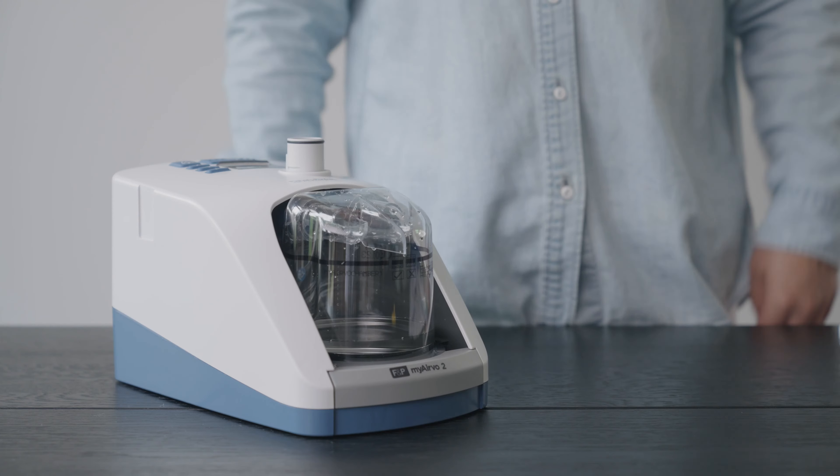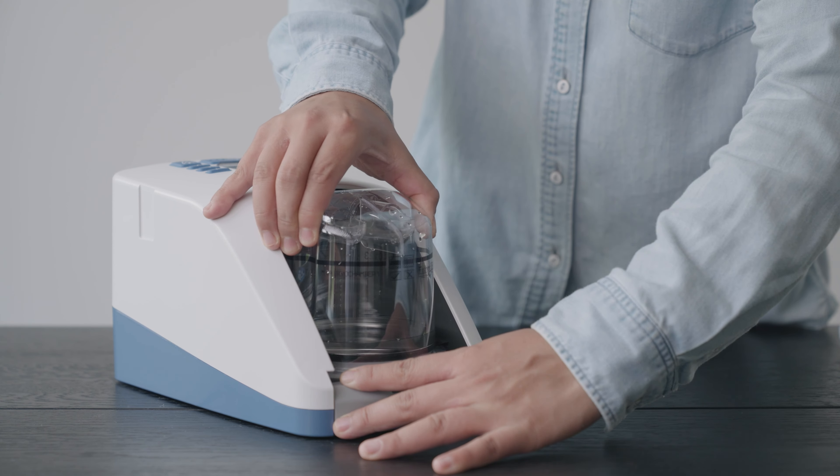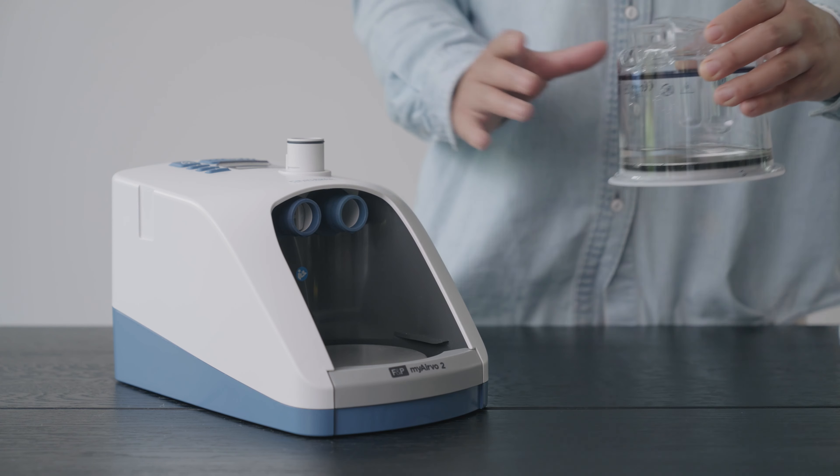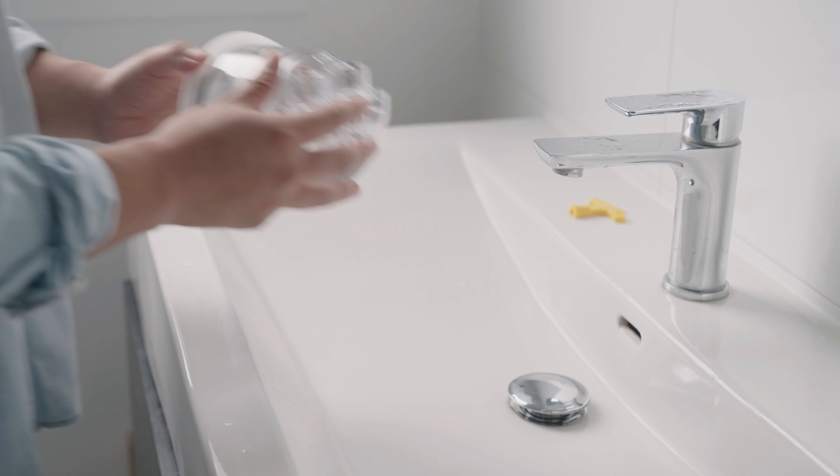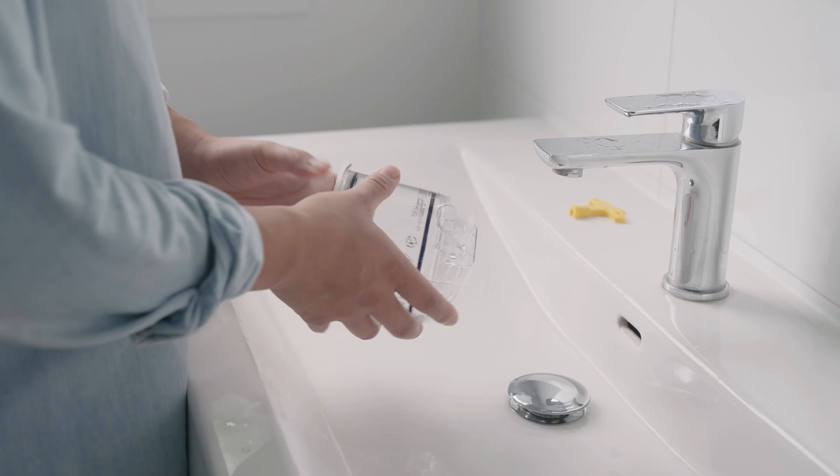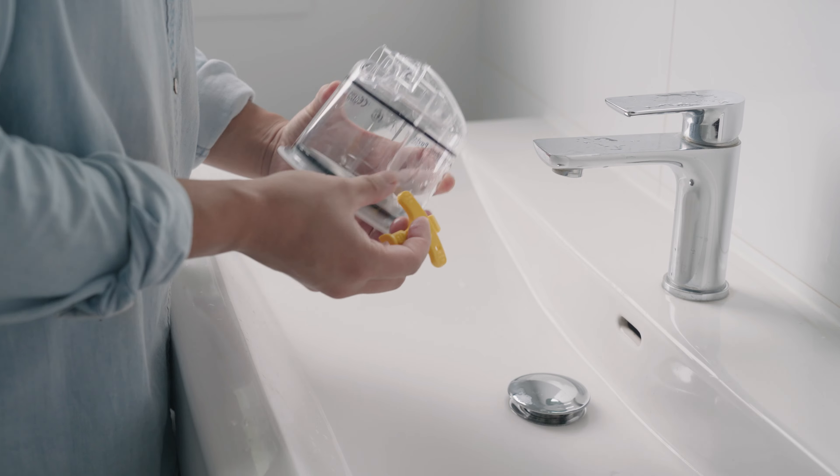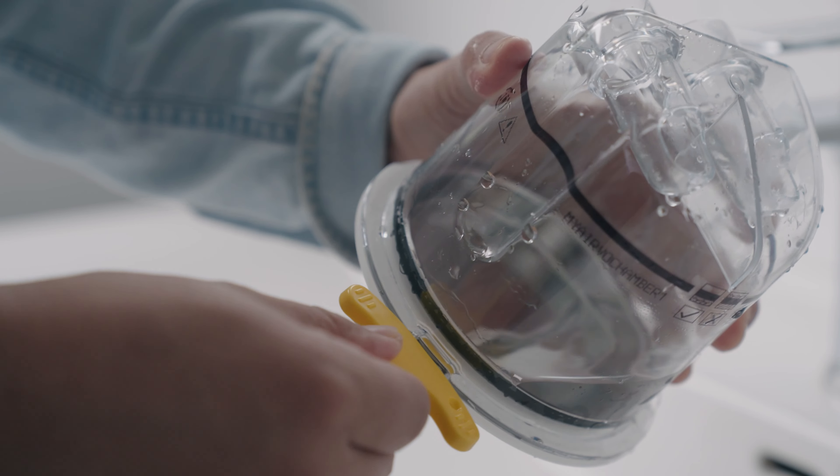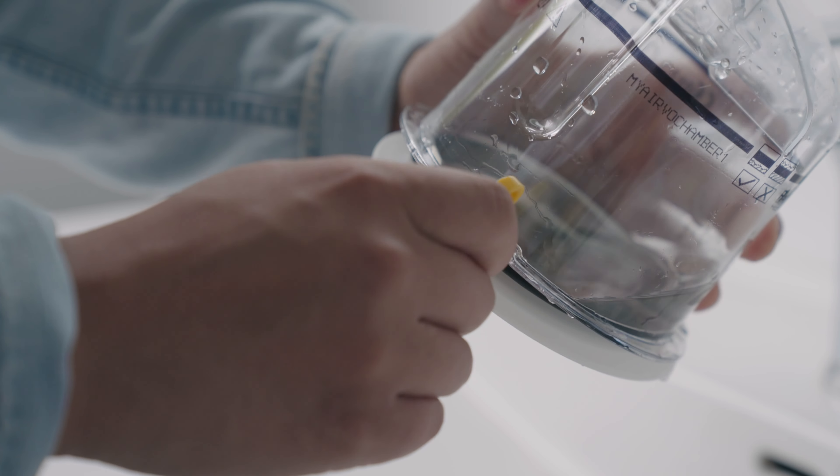After you have finished therapy and completed a drying mode cycle, hold the finger guard down and slide the chamber out of the Maiva. Discard any remaining water by tipping the chamber upside down. Separate the chamber dome from the base with the removal tool.